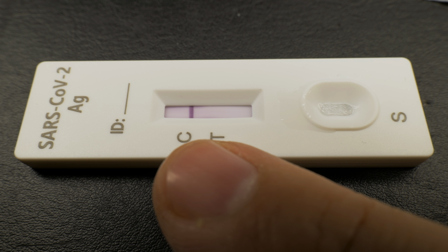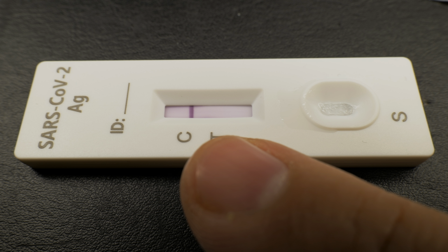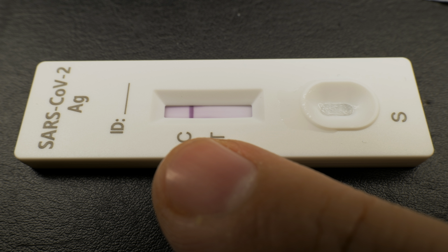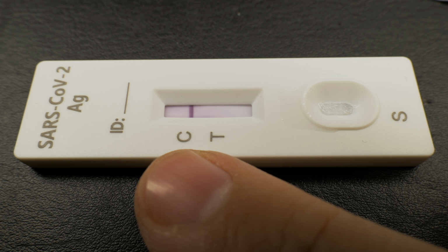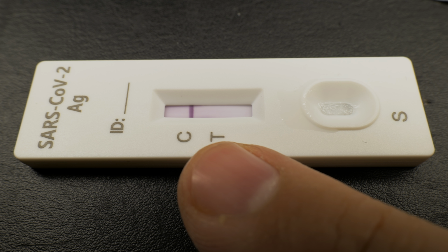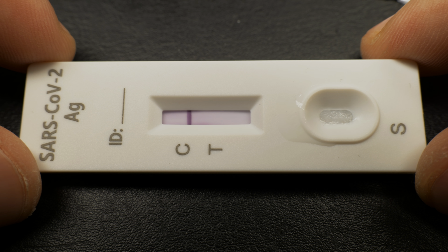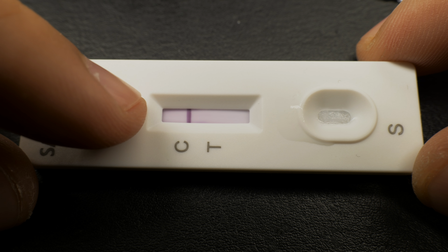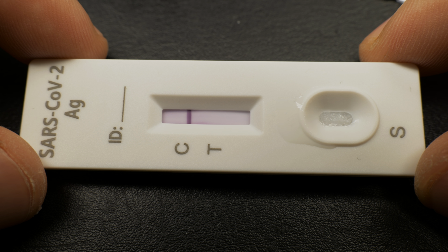And if there is no line on the C line, it's an invalid test. If you have one line on the T line and no line here on the C, it's also invalid. So you should have either one line on C for negative, or one line on C and one line on T for positive. Any other combination is an invalid test. Most important is that the C line should show, so it shows that the sample is valid.